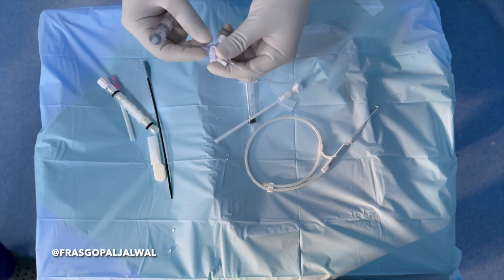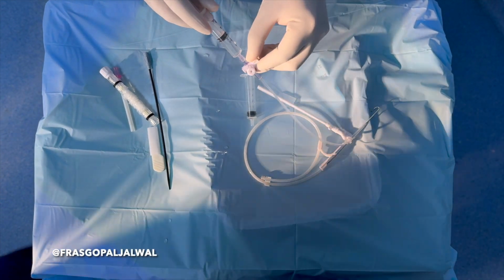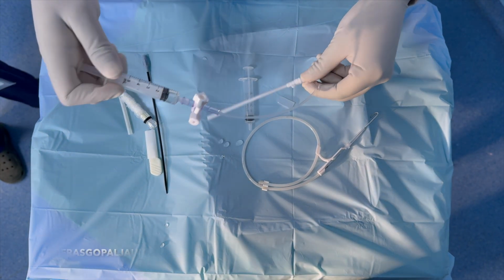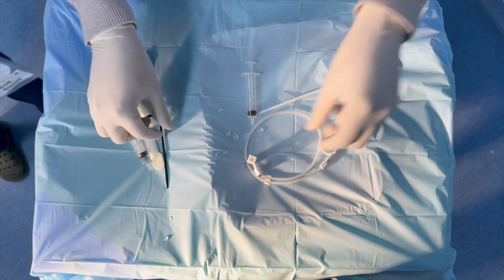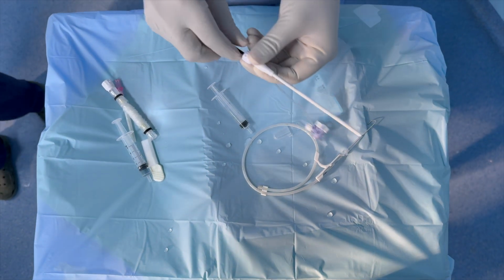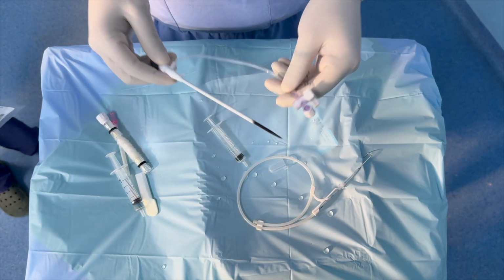First, we have to check the patency of the introducer sheath. Here you can see, okay, it is fine, and then we have to insert the dilator into the introducer sheath. So now it is ready.